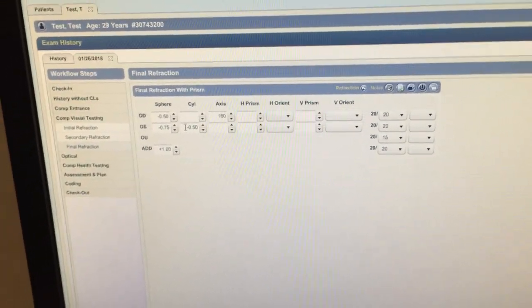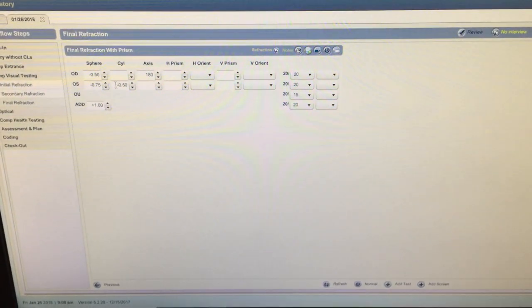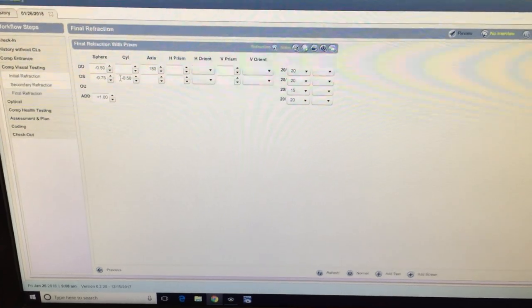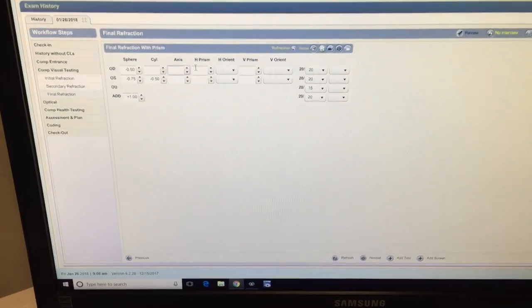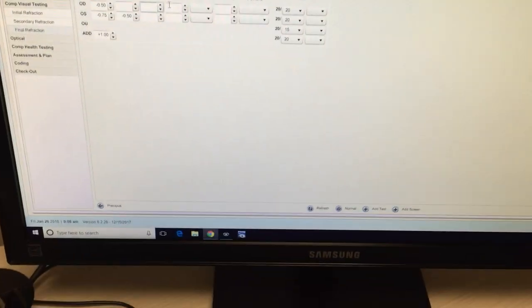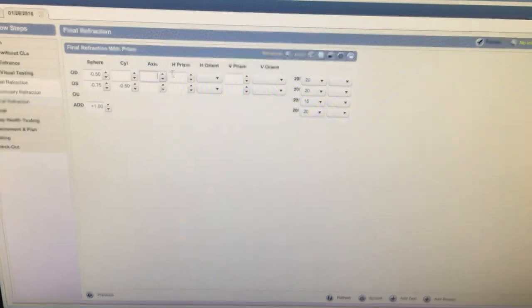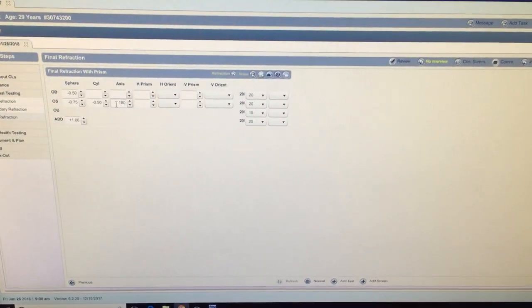One quirk about the system: when you have a spherical refraction, Revolution will sometimes put 180 degrees in the axis field. On the right eye, the final refraction was minus 0.50 sphere, but there's a 180 degree axis on there — that shouldn't be there. Make sure you check and delete that whenever you have a spherical prescription, because the optician will be confused and think there's supposed to be cylinder there. Another quirk: sometimes it doesn't show the axis that it needs to be on — mainly the 180 degree axis. On the left eye, minus 0.75 minus 0.50, and then the axis field is blank when it should be 180. So you'd have to add it manually. Just some little quirks and glitches to watch out for.